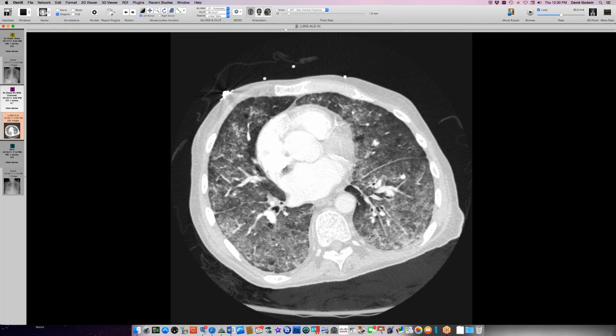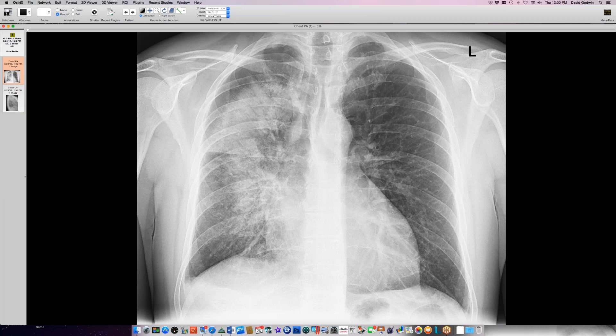Finally, let me show you this case of really dramatic right lung consolidation, particularly upper lobe, in a person with acute mitral insufficiency. This is one of the most striking examples I've seen of selective right lung edema, because the direction of the regurgitant jet points the blood flow to the upper lobe on the right. The left lung at this point is completely dry-looking and quite good. There's an accompanying pleural effusion. This person got a lot better after the mitral valve was replaced.